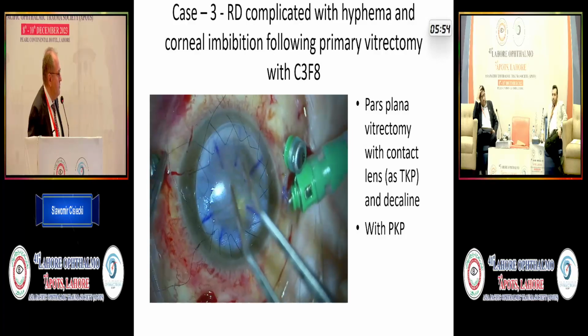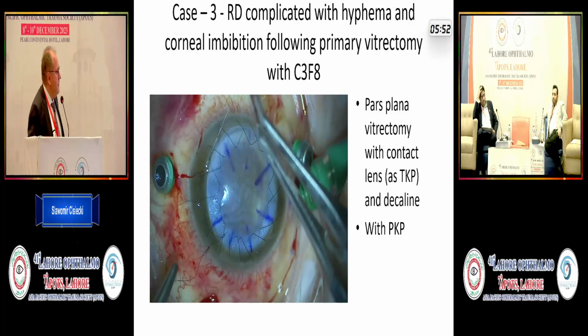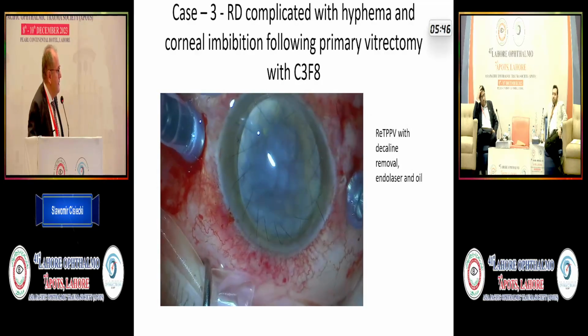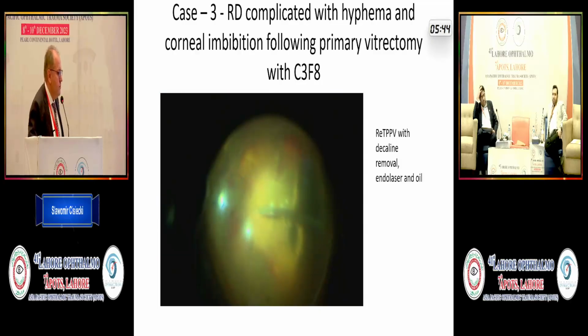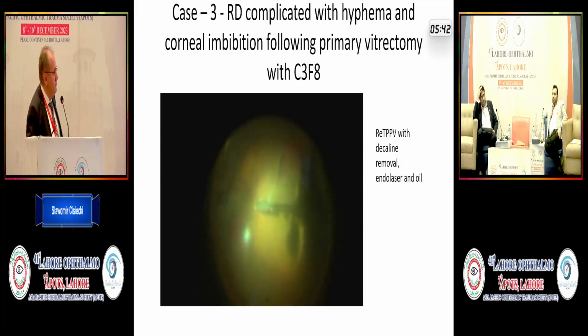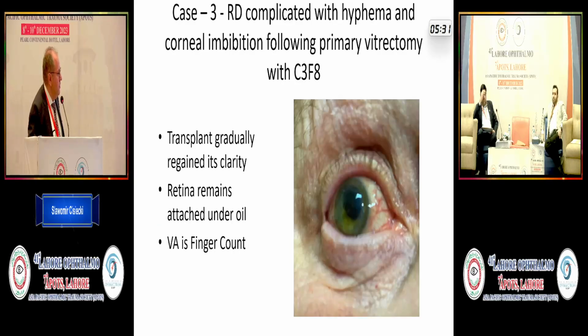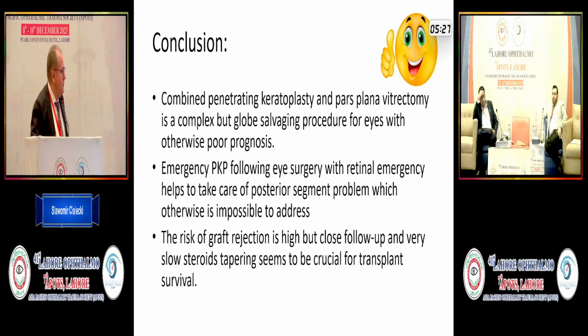So this is how it looks. I left the eye filled with PFCL, and this is the second surgery. After 2 weeks, the visualization was good enough to remove some membranes and exchange PFCL against silicone oil, and we were able to save the eye.